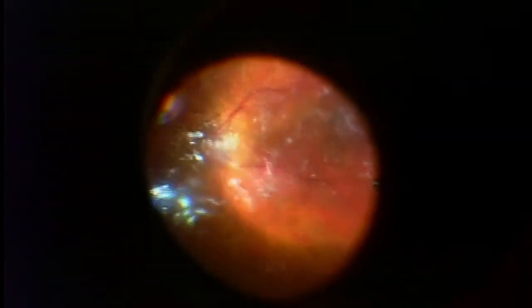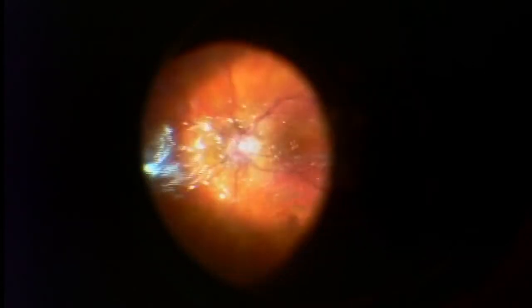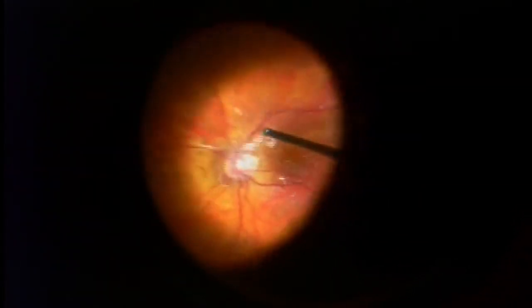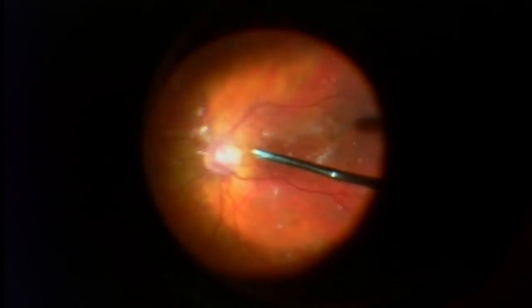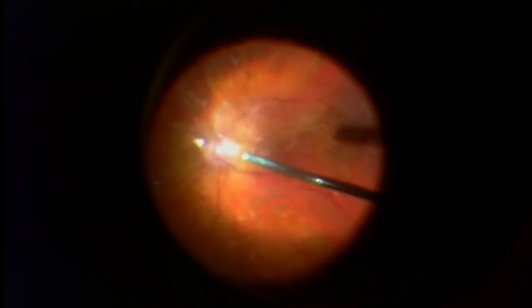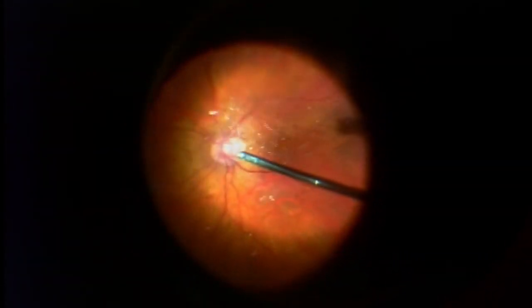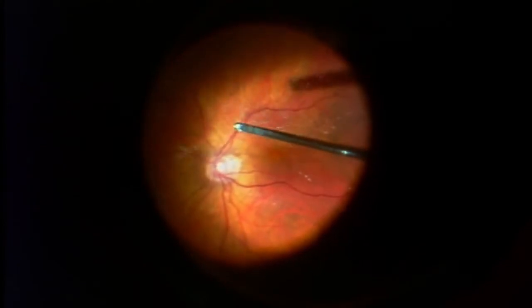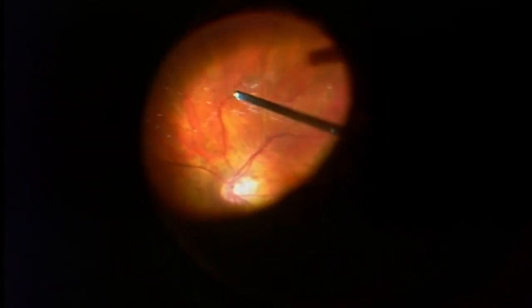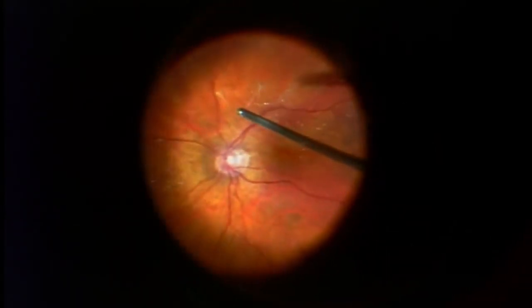Once we get started, this is a typical appearance of asteroid hyalosis. For those of you who've watched many videos, it looks exactly like Kenalog — kind of white deposits that are suspended throughout the vitreous. Believe it or not, the asteroid hyalosis itself does not usually cause complaints of floaters. This is a patient who incidentally had asteroid hyalosis and had long-standing floaters for several years.